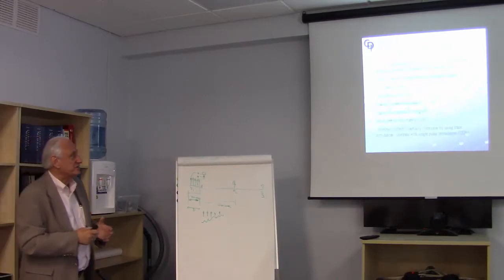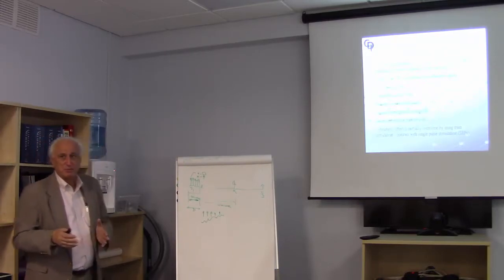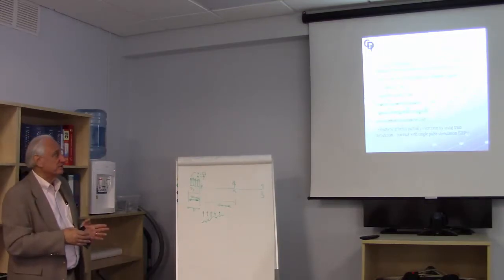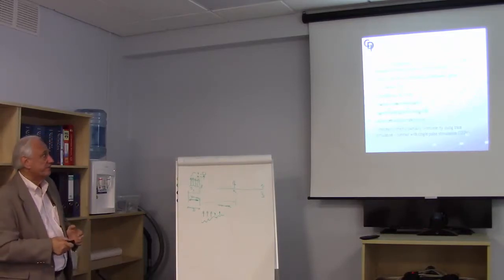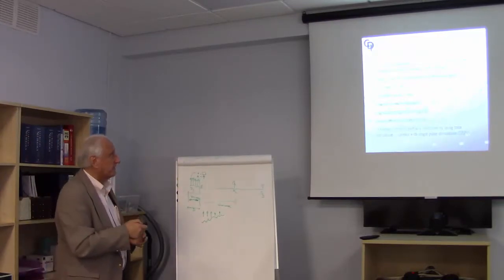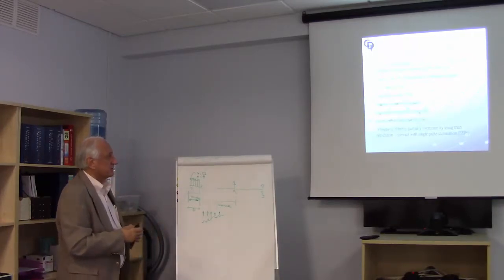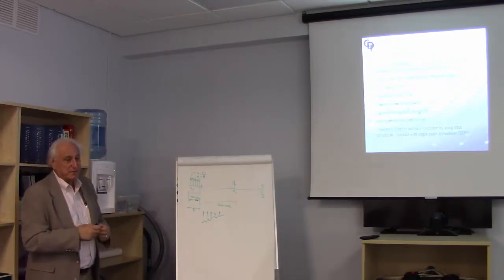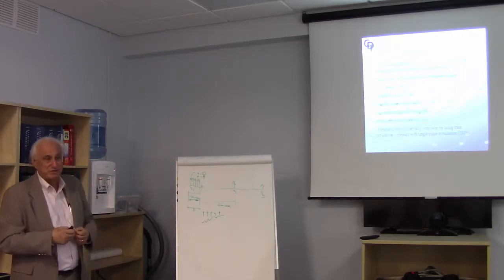Effective anesthesia. This is the biggest problem with interpretation of motor potentials, the effects of anesthesia, and these are extremely sensitive to anesthetic regimes. They're easily suppressed by the inhalation agents. So we talked about the isoflurane, the sevoflurane, and desflurane. These gases just have an incredible ability to suppress motor potential.